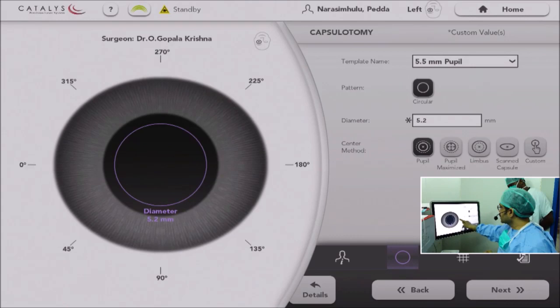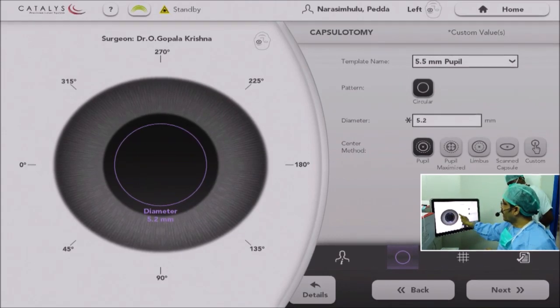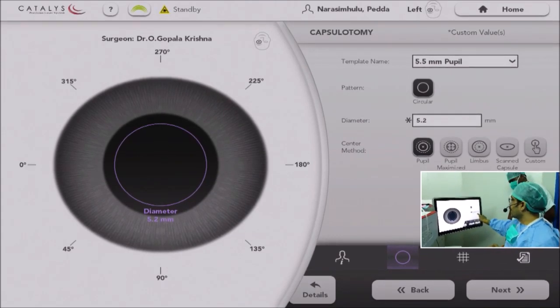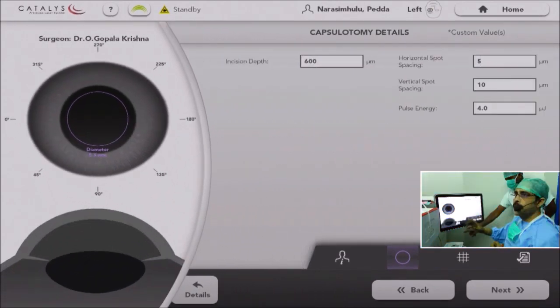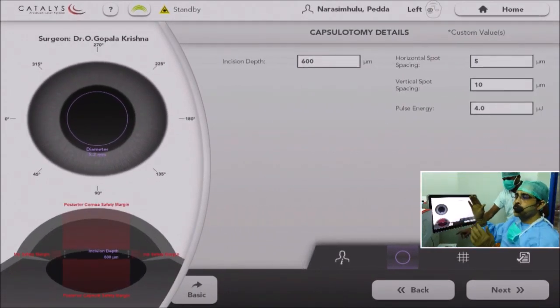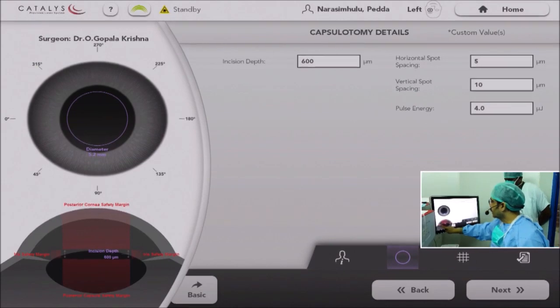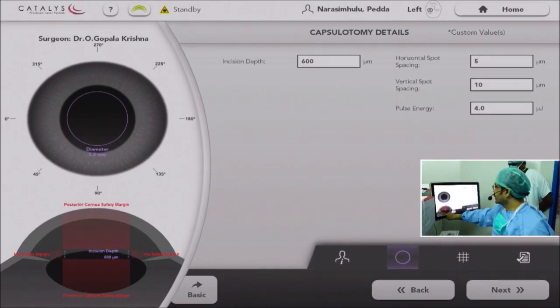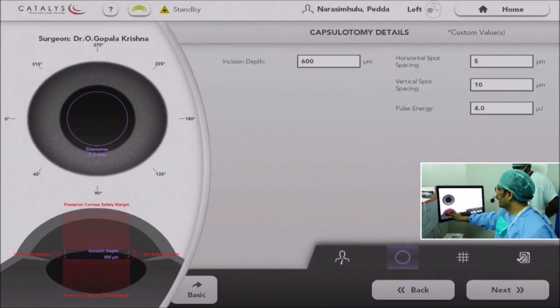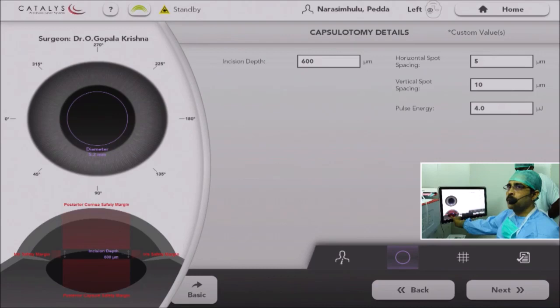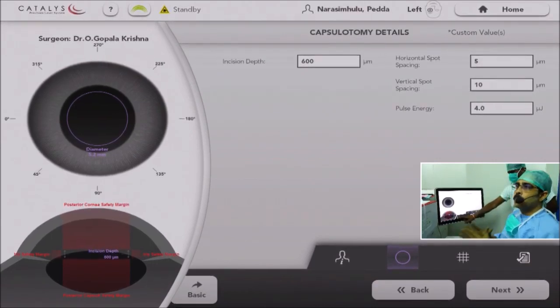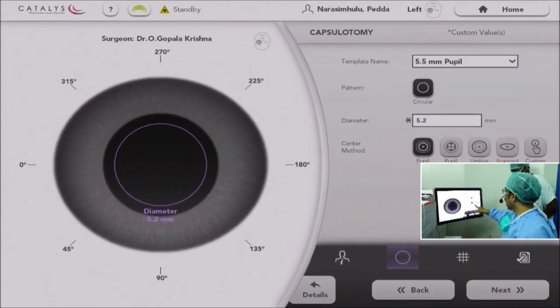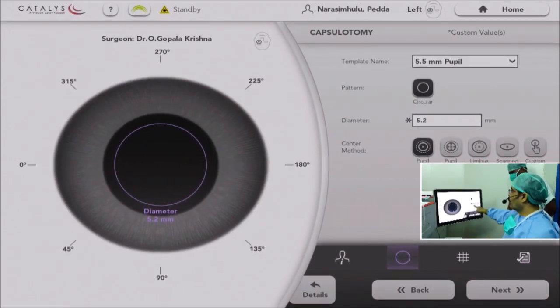The third is a scanned capsule. This is the most important one, because it takes the geometric capsular bag, finds its center, and keeps the capsulotomy centered onto that geometric capsular bag. But most surgeons will use the pupil maximized option, because if you take the geometric or scanned capsule, sometimes the capsule margin may go behind the iris if the pupil is not very well dilated or centered.